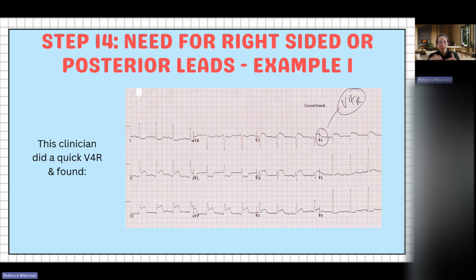If you're an Epic site, it'll usually be found within Epic in the diagnostics section. If you're not an Epic site, they'll probably send a printout, but it's really cool to look at. You can see, based on where the patient was infarcted and where they stented, why certain things were infarcting. It's pretty interesting.